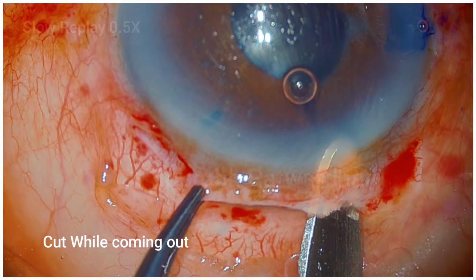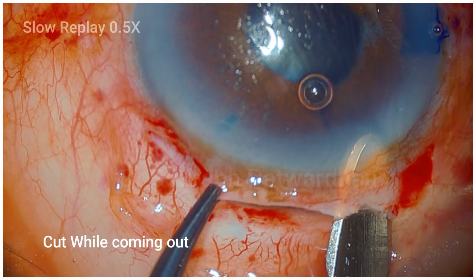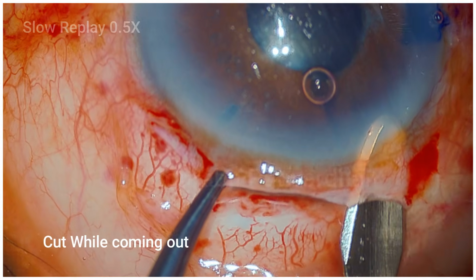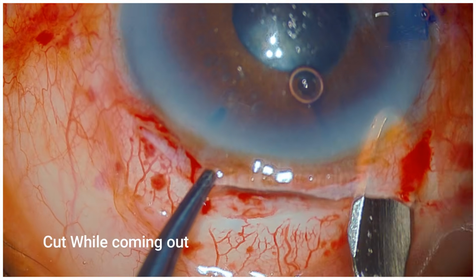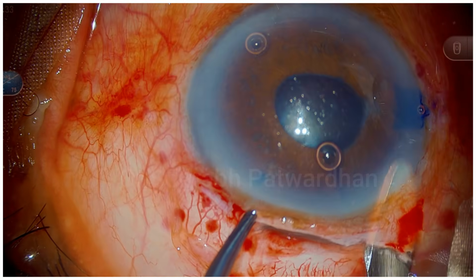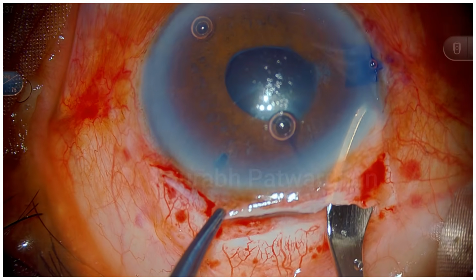So the dictum is cut while coming out when you are making the scleral tunnel. You have to master this technique of making a manual scleral tunnel, because it is an extremely important part of the manual SICS procedure. If you make a very deep tunnel, you get a premature entry and iris prolapse.